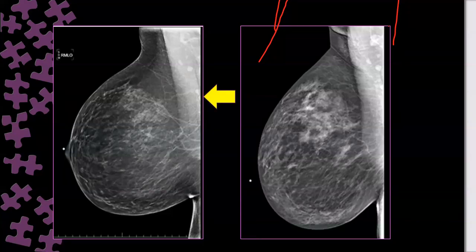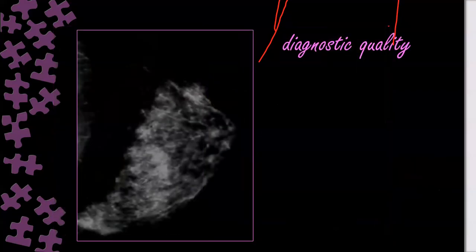So the problem is related to malposition, and improper positioning results in inadequate compression. When corrected, everything becomes nice. And here, this is very clear. Under exposure.